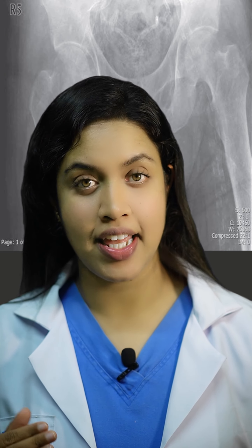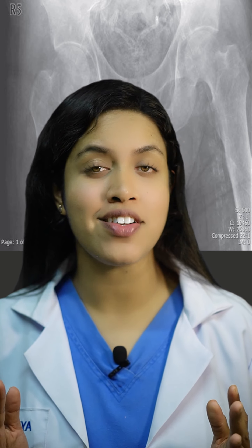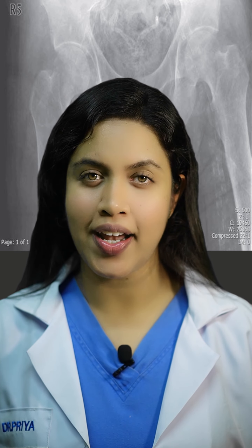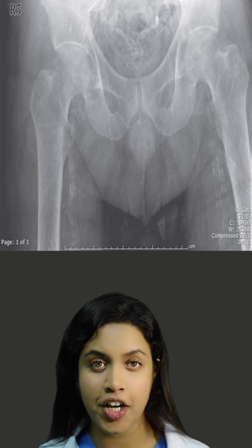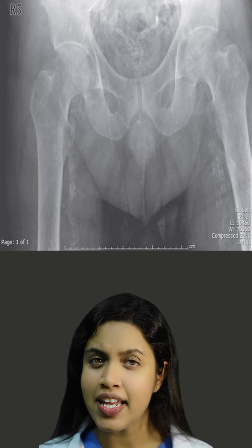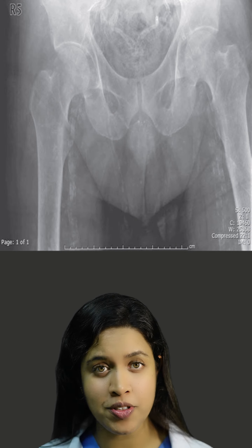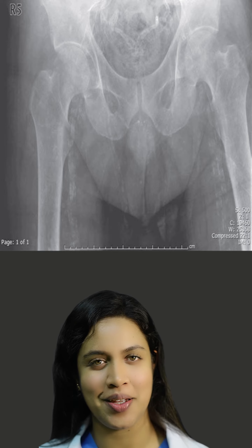An elderly woman has experienced a fall and is unable to bear weight on her right hip. Let's take a look at her initial imaging. Here we have a radiograph of the pelvis. Take a moment to observe the findings. What do you see?